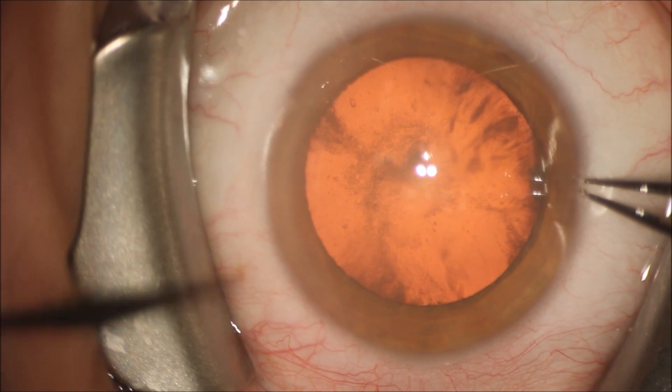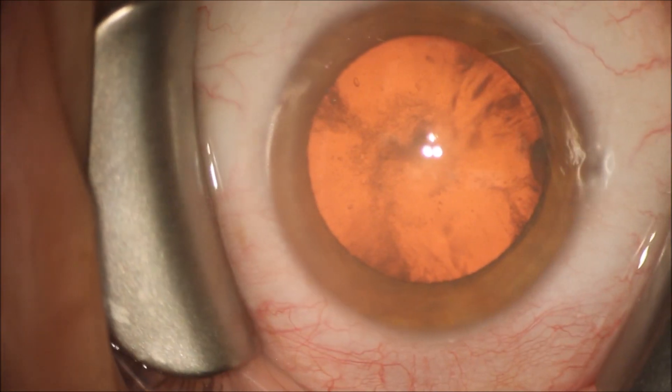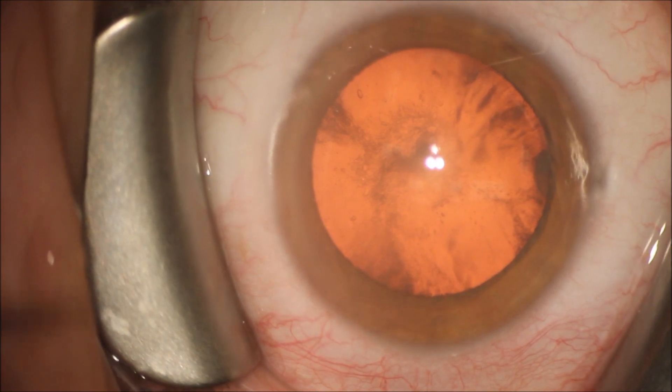This is a routine cataract case. You can see the patient has cortical, nuclear sclerotic, and posterior subcapsular cataract.